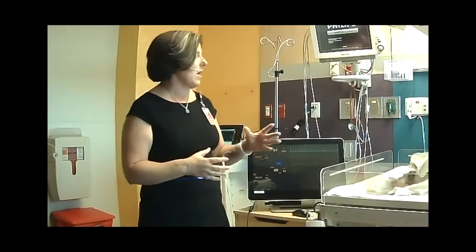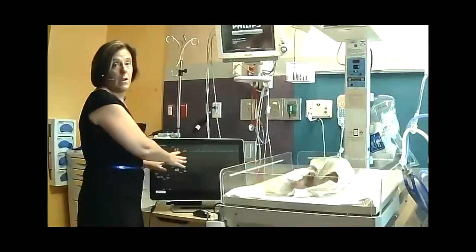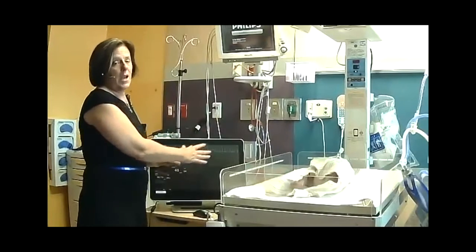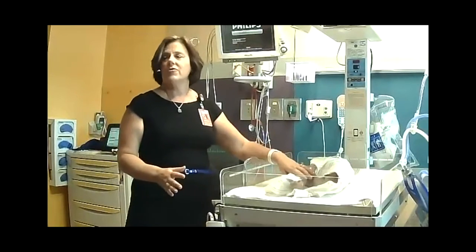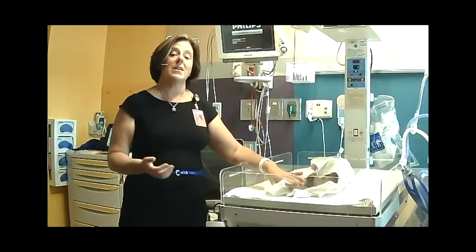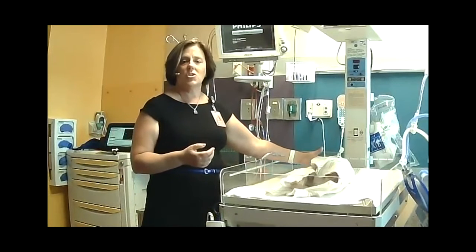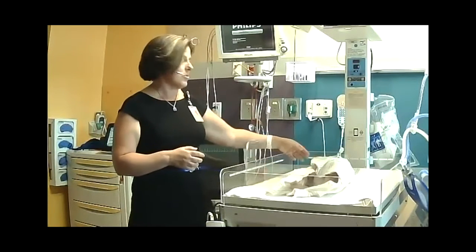As a parent, you're here. I always would encourage you to look here before you look here, okay? Don't stare at this. Look at your baby. Are they comfortable? Are their feet warm? Are they peeing? All those things are great. Can I calm my baby? I don't know if I can touch them with these tubes. Actually, you can. Have your nurse work with you.